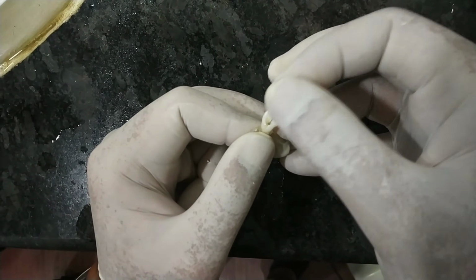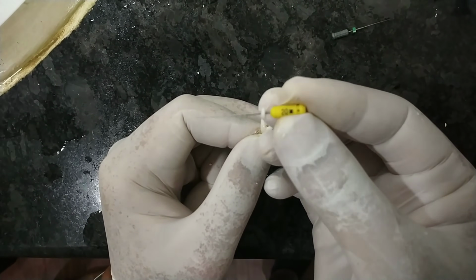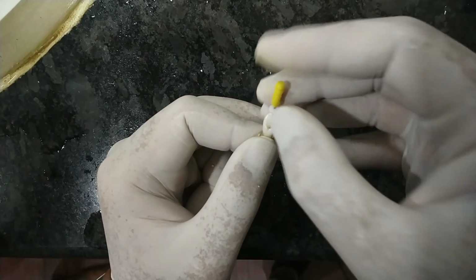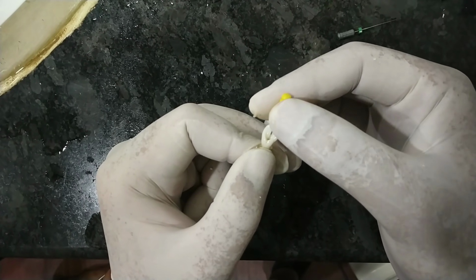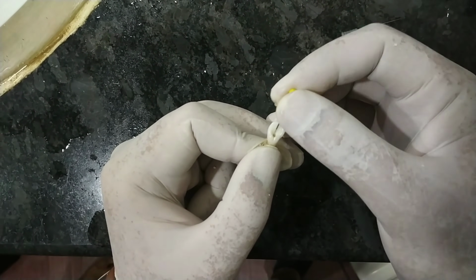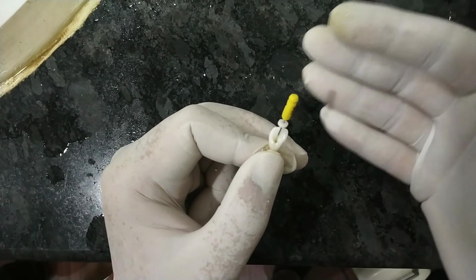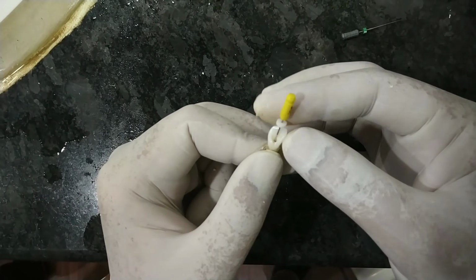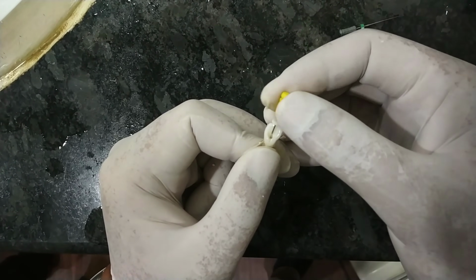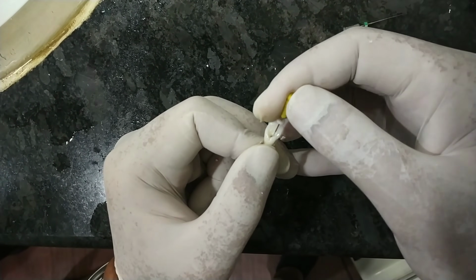So till 15-20 we have to enlarge. And this is the 20 number file, the K file number 20. And again we are using it like this. So why are we using the K files? To make a straight line access. Initially you cannot insert the Protaper files. Rotary will come later, how to use the rotary, but we'll first learn how to do it with K files and Protaper. So this is the way you should do it, and you should file in all the directions.